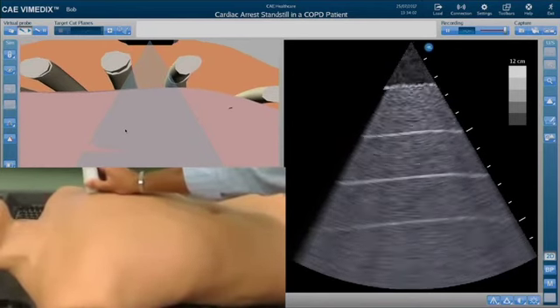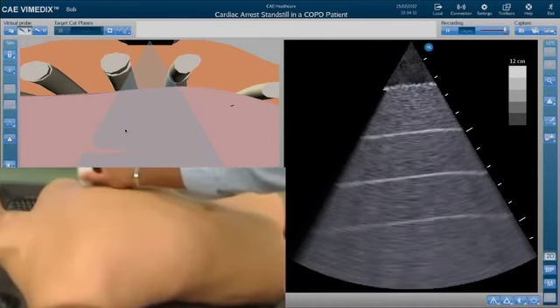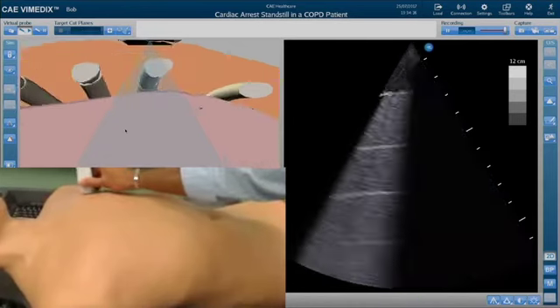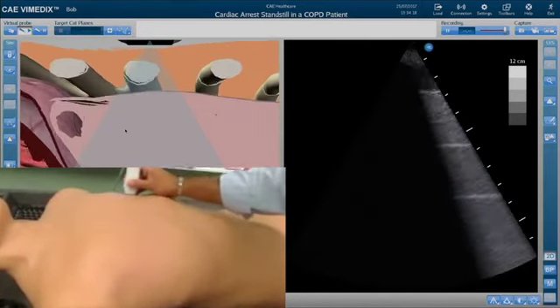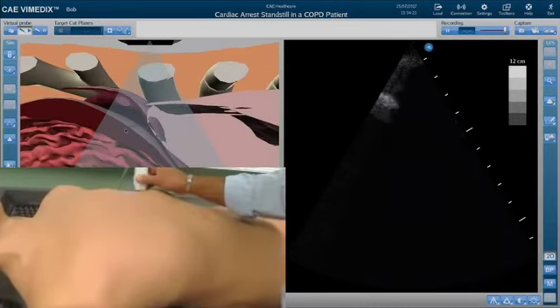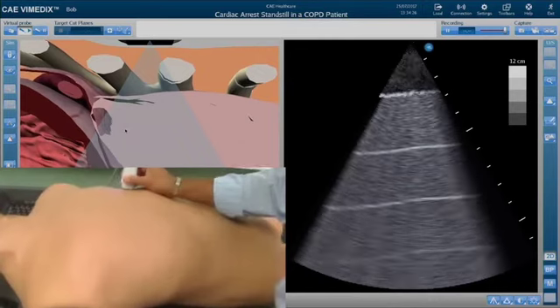But this is again the concept of evaluating the lung parenchyma for airspace disease. You follow the examination exactly how you do for the lung pleura, following again from the mid-clavicular line, working your way laterally to evaluate the entire anterior aspects of the lung fields. And I ask you to kindly look at the PowerPoint images to evaluate the full examination.